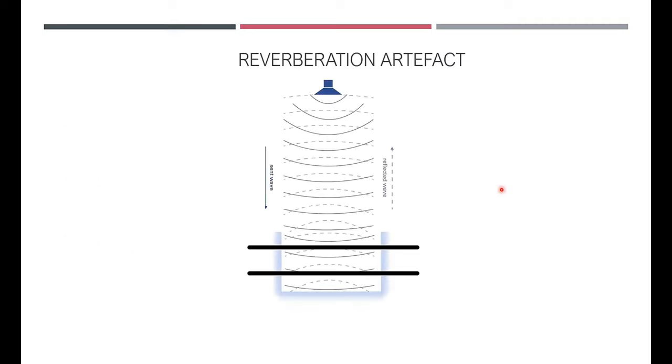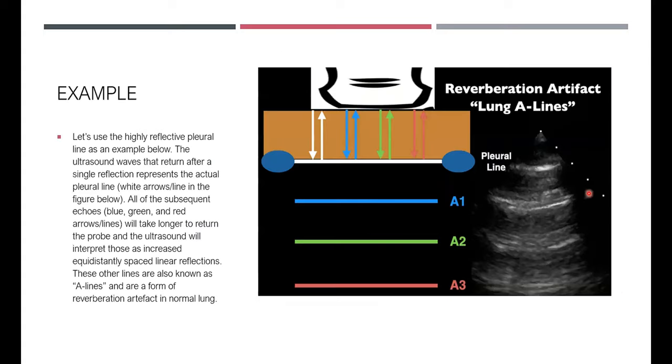So what is happening is that the lung ultrasound sound waves are percolating through. They hit the pleural margin and then they hit lung tissue. And then you have them reverberating back to the transducer, but against these two surfaces, the pleural margin and the lung tissue itself, causing a kind of shaking, and these are horizontal reverberation artifacts. So classically what they do is produce A lines. And here you can see classical attenuation of the A lines as you move further down, because there's attenuation of sound waves as you move in. But what is happening between these interfaces is basically these sound waves bouncing off each other to produce these horizontal artifacts.